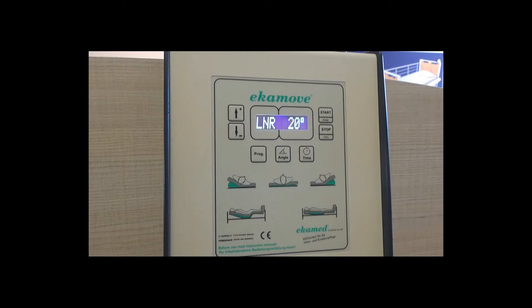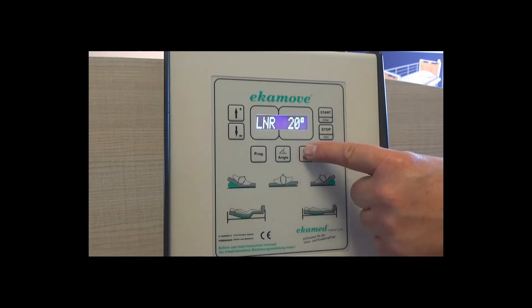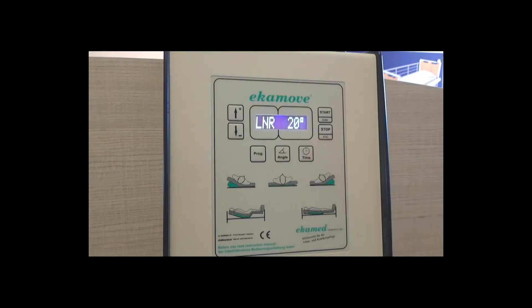Once calibration is complete, the screen displays the standard factory setting: LNR, meaning left, neutral, right — 20 degrees, 20 minutes.